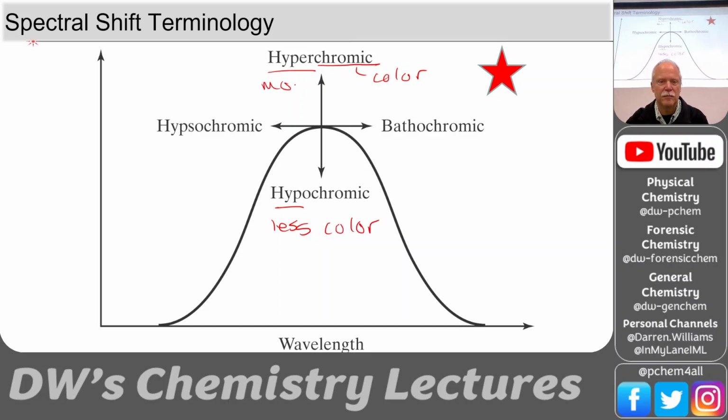And so you'll see this in some of the descriptions. Read in 30 seconds before a hypochromic shift happens, or whatever, before the color fades. They could just say color fades, but I think they want to sound very technical. Okay. And then bathochromic, and here's wavelength. So this is long wavelength, and this is short wavelength. So bathochromic, so that would be a red shift.